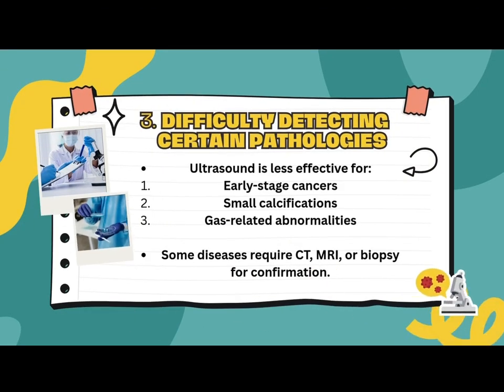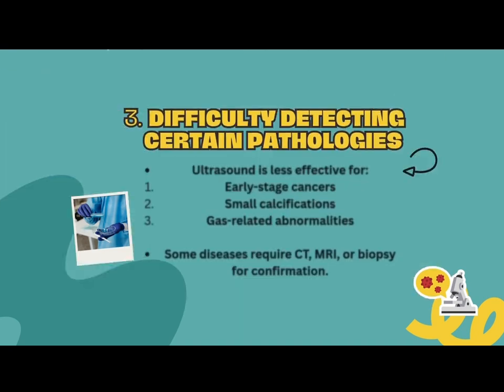Furthermore, it has difficulty detecting certain pathologies. Ultrasound is less sensitive for detecting certain diseases, including early-stage cancers, small calcifications, and gas-related abnormalities. Because of this limitation, ultrasound often cannot provide a definitive diagnosis on its own.